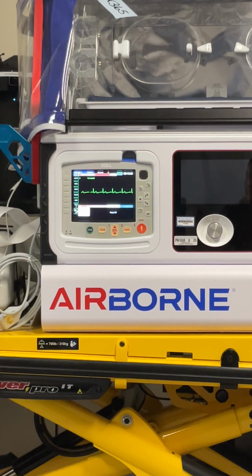We didn't do arrive when you first get there, because we figure the baby's usually hooked up to something you're not messing with, so you write your time down. But this keeps track for you. Then when you leave the unit, you can say leave, in isolate, that kind of thing. That's for us, so that when you print the report at the end, it's all in there.